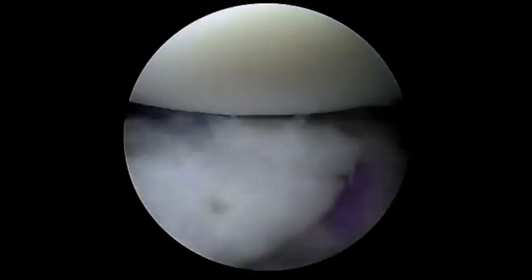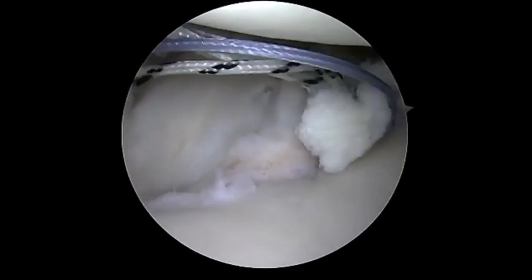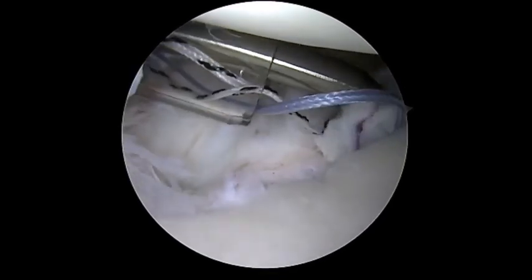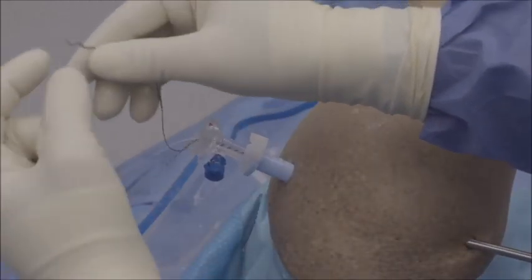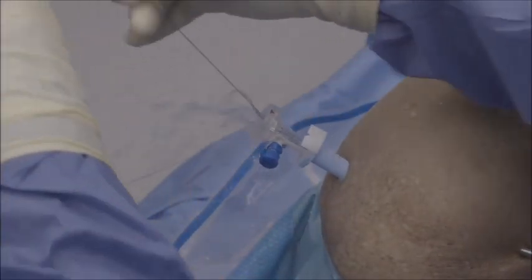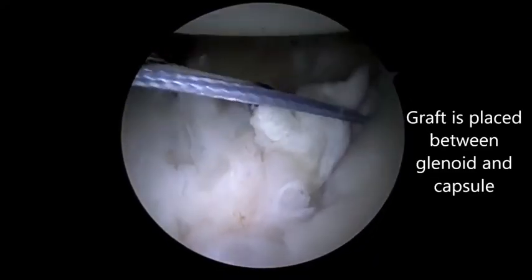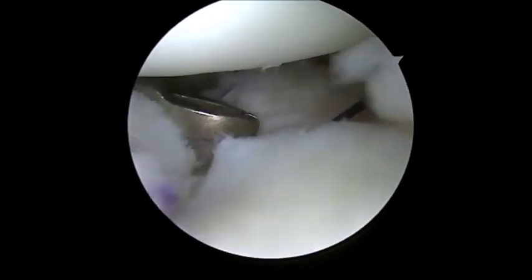Once the graft has been placed in the appropriate position, it should be sitting right in between the labrum as well as the glenoid. The link suture that was used as a traction stitch is then converted in order to provide an additional stitch that will be passed through the capsule. This demonstrates the appropriate placement of the graft between the glenoid and the capsule.